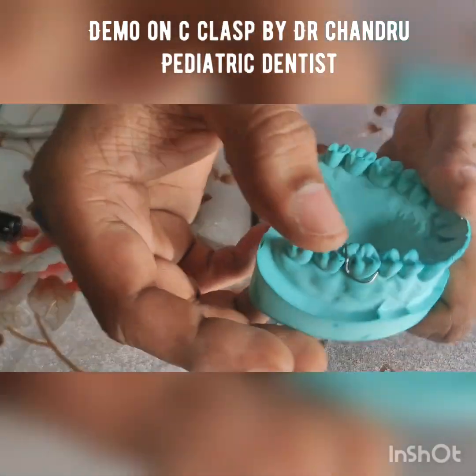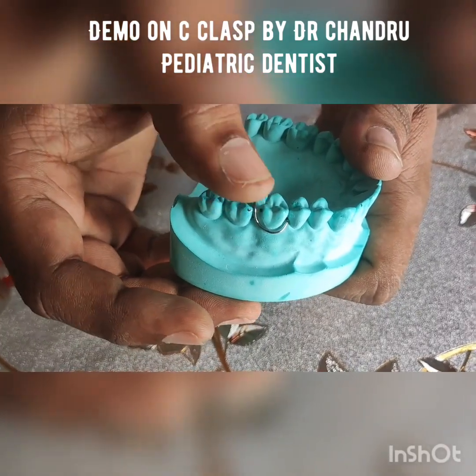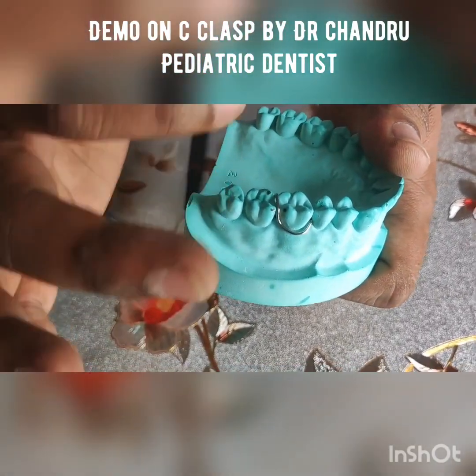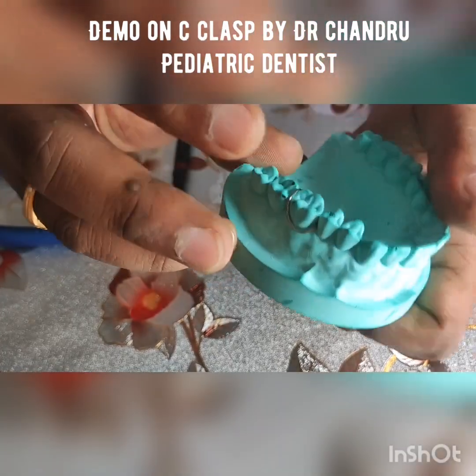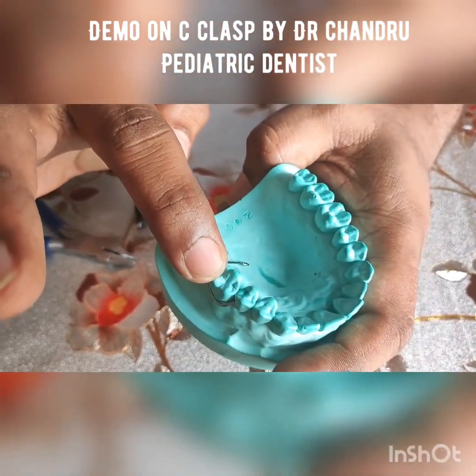Now this occlusal interference means that there should not be any occlusal lift, or lift of the component, when we touch the occlusal area of the component. Now you can see that even after I am passing my index finger, there is no lift.